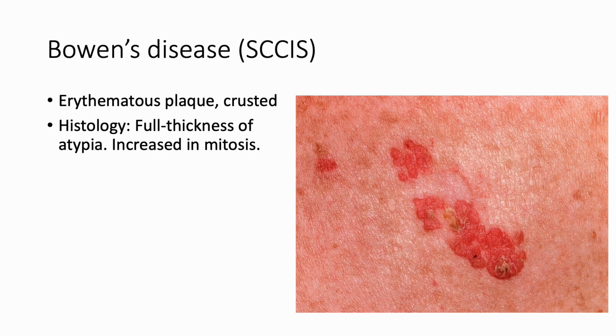Squamous cell carcinoma in situ can derive from a long-lasting actinic keratosis. However, there are other types of squamous cell carcinoma in situ. They are de novo. Usually it is associated with some viral infection or some other genetic abnormality. In this situation, when we see de novo squamous cell carcinoma in situ with a very unique histology, we give the diagnosis of Bowen's disease, which is a term very specially used in the Dermpath world.